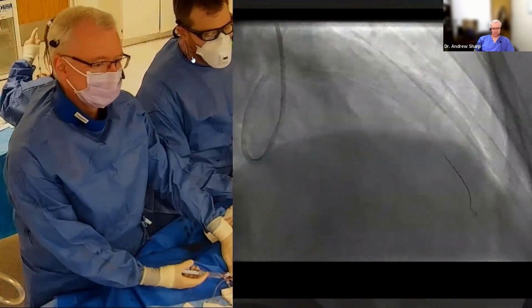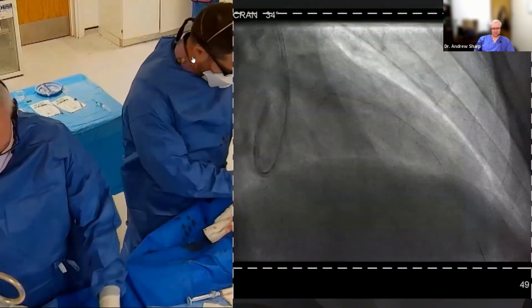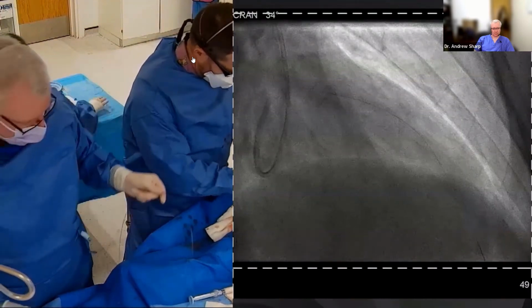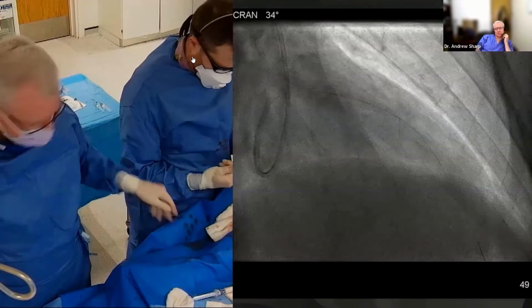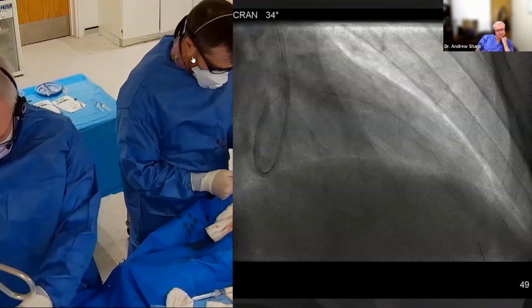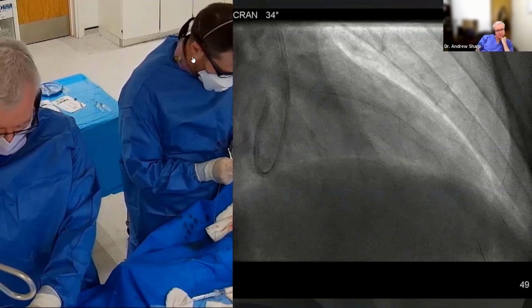Good. And if we have the IVUS catheter back now, please. Yep, sure. And that's the other thing about IVUS, it can reduce contrast even if you're not trying to do a zero contrast procedure. Because why do you want to take 4 different views to see if there's a dissection at the exit when we're about to find out properly if there's a problem at the exit?